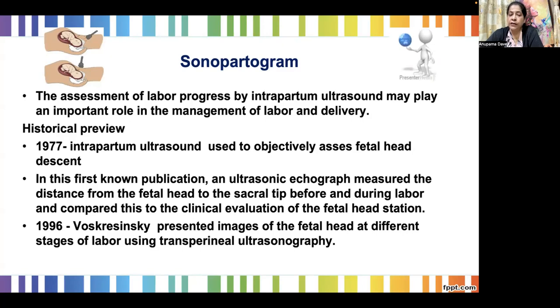In addition to that, it also compared clinical evaluation of fetal head station. In 1996, Woskarinsky presented images of fetal head at different stages of labor by using a transperineal ultrasound.